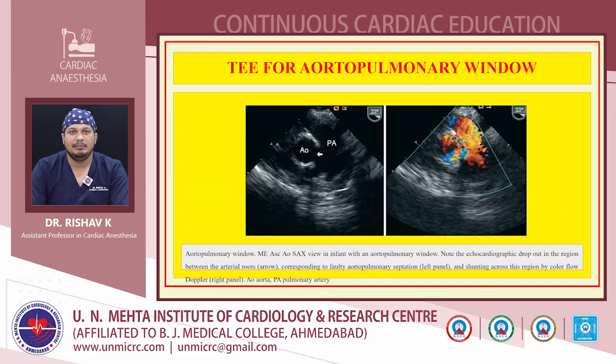Coming to some of the TEE images, this is showing an aortopulmonary window in the mid-esophageal ascending aorta short axis view, which, as I have told, we can obtain from a mid-esophageal aortic valve short axis view and then withdraw the probe slightly. Here it shows a clear communication between the aorta and the pulmonary artery. But again, as I have told in the previous slides, we have to exclude the presence of an echocardiographic dropout, especially if it is not documented in the preoperative study.